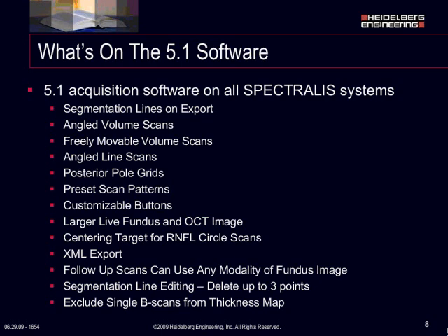You can do follow-up scans in any modality at all. So if you take a photograph, an OCT, or an FA-OCT, and then the patient comes back a month later after having an injection, you can then follow up that scan with an infrared OCT. So whatever modality you use, you can follow that up with a different modality. Like I said, if you do a fluorescein OCT first, you can follow it up with a red-free OCT or an infrared OCT.